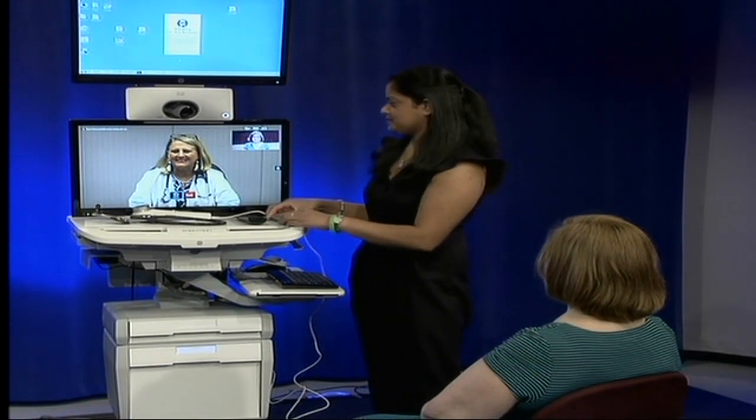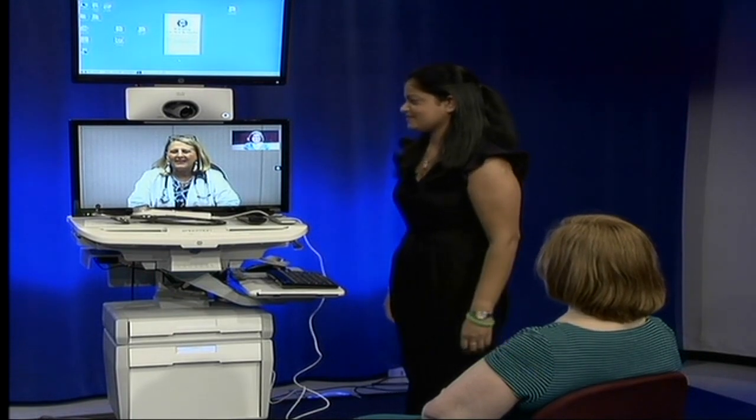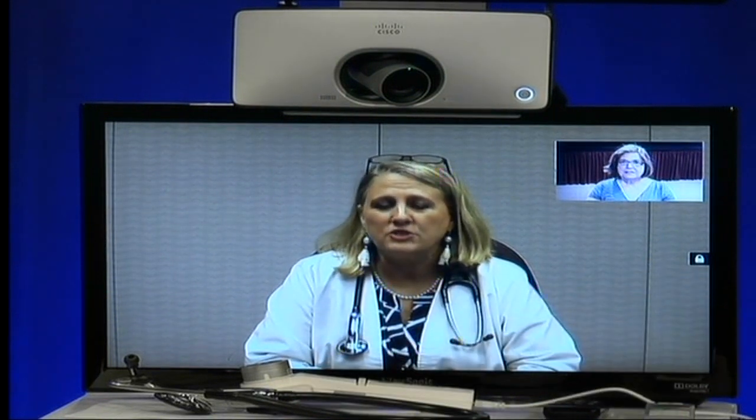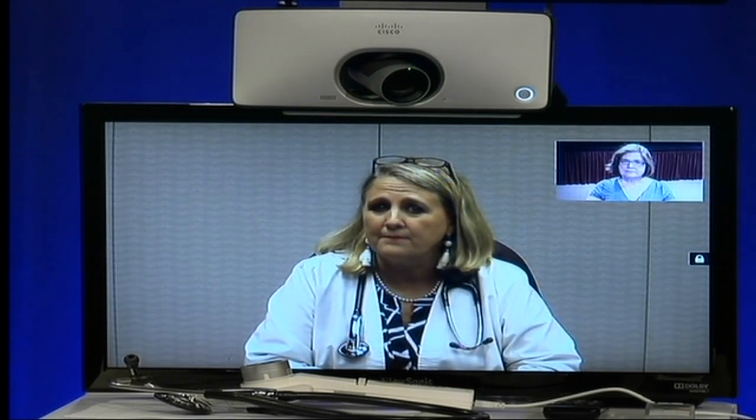Hello, Dr. Wilson. Good morning. Hey, Fern. Hi, Dr. Wilson. How are you? Doing well. Thanks. Great. I have looked at your vital signs. They all look good, and the labs that I have available to me, they look pretty good as well. I'll take a peek at the others when I get those results. Are you just here for your general checkup, your refills today? And then I have a little spot I want you to look at. Okay, that'll be fine. We'll start with listen to your heart and your lungs, and then I'll look at the spot. Okay. We'll go from there.